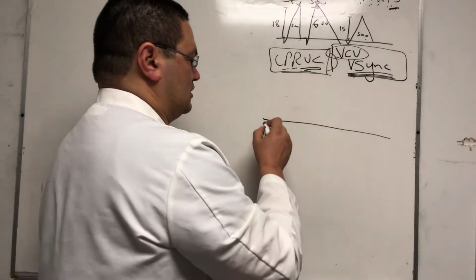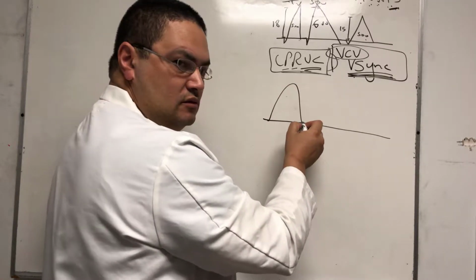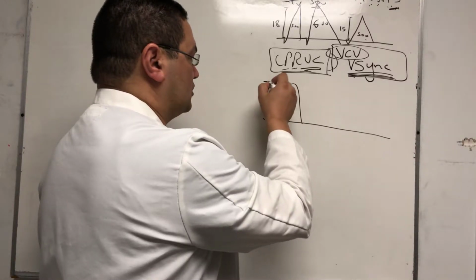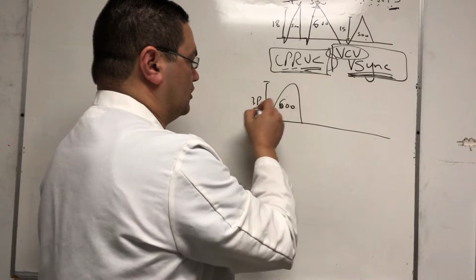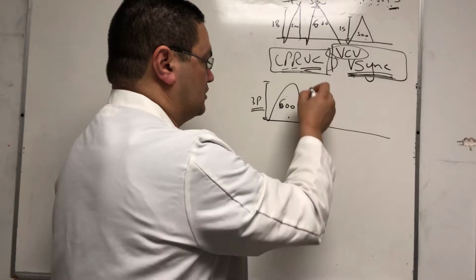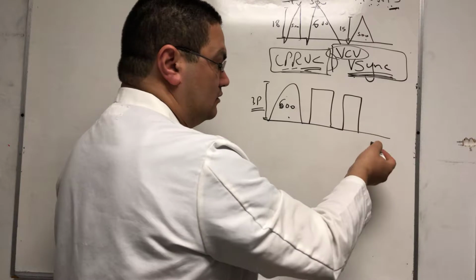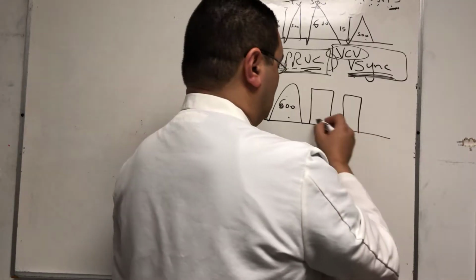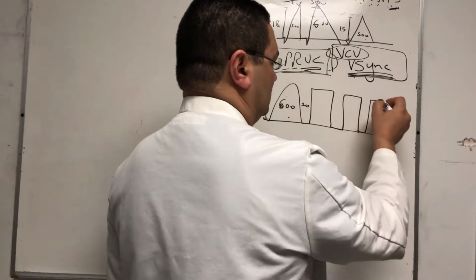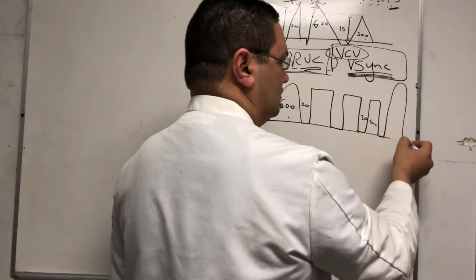But the machine, what it does is that it gives the first breath as a volume control breath of 500 or 600 tidal volume that you ordered, and then measures how much inspiratory pressure is required to achieve this 600 tidal volume, and all the subsequent breaths are pressure delivered breaths until your compliance changes and your 20, let's say this is 20 that's required, and your 20 resulted in a smaller tidal volume. Then the machine retests again.